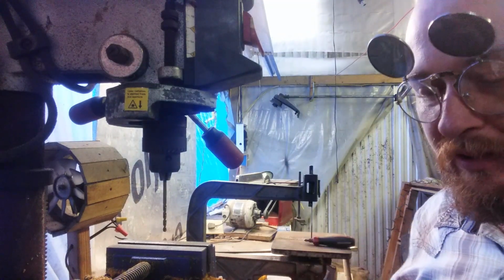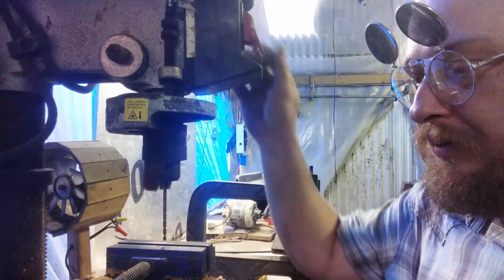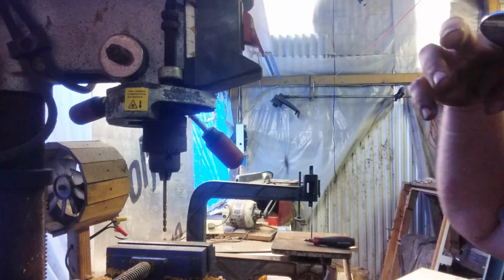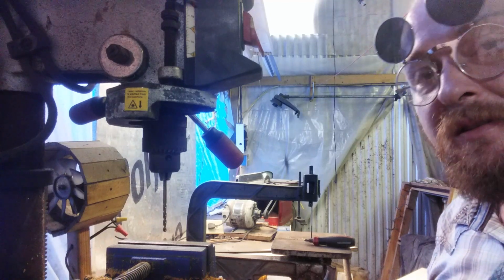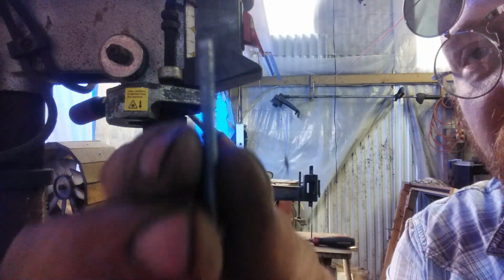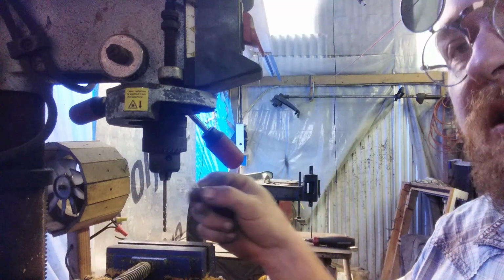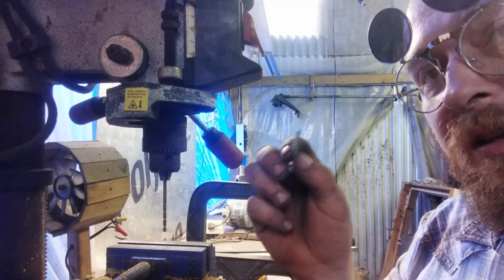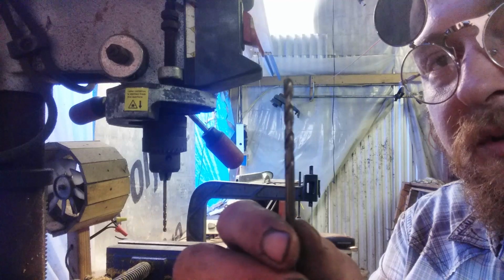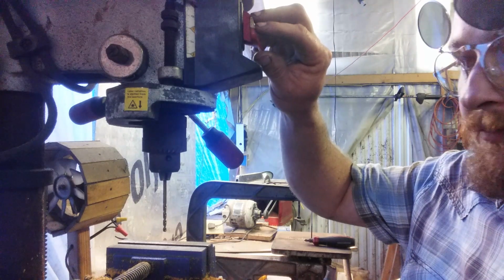Alright, here we are at the press, and I'm not going to wear any gloves. I've set the drill press vise to where it will back up the piece nicely and the bit can pass through. This can be very, very dangerous, so always keep your weather eye open for problems. So here's the diameter of fastener that I'm going to be using. I've set up a 9/64 bit, and if the tolerance is too tight and it won't move freely, well then I'm going to move up one size. We have 5/32. So let's get her started.